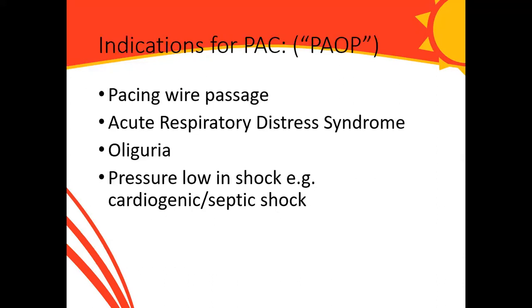So what are the indications? Recently, passing a pulmonary artery catheter has fallen into disfavor because there are other ways you can monitor and measure the parameters that a pulmonary artery catheter can measure, and it's more technical and it's fraught with increased complications. So passage of a pulmonary artery catheter is not the darling of many critical care physicians. However, it's important for you to familiarize yourself with it.